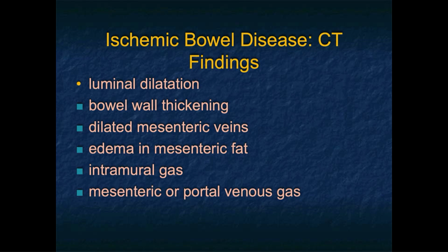Now, we all have an older population now, and in the acute abdomen, in the ER setting, one of the most common things we worry about is ischemic bowel. I mentioned at the beginning of the talk, in determining whether you're doing arterial or venous or both, I think older patients where ischemia is in the differential, you may want to err on the side of doing dual phase imaging. The radiation dose is not very high. The patients are a bit older. Ischemic bowel is a challenge.